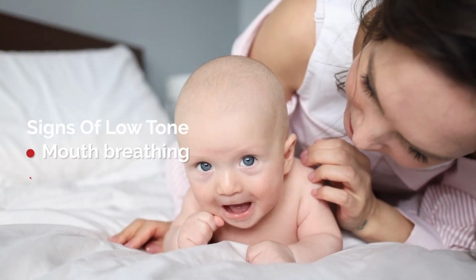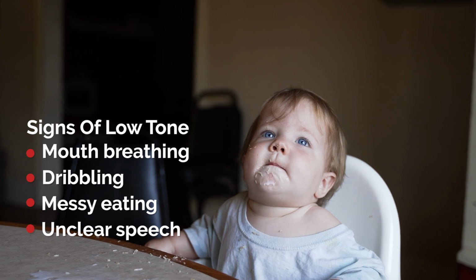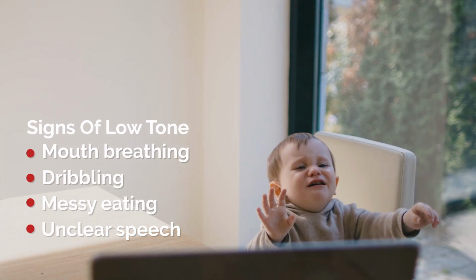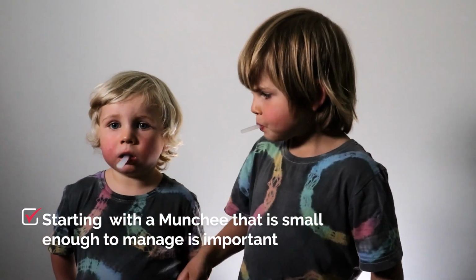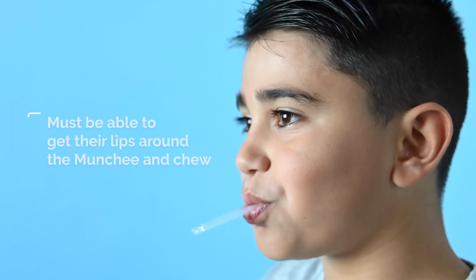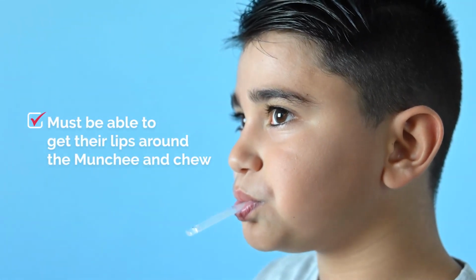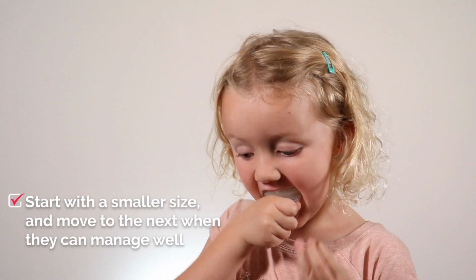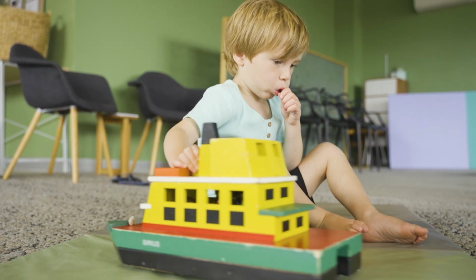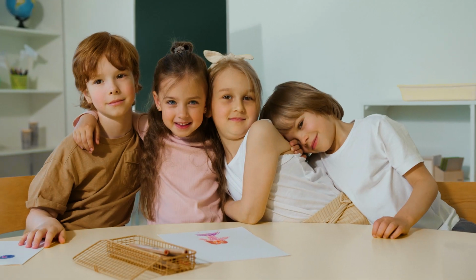So if we have mouth breathing, dribbling, drooling, messy eating and unclear speech, for example, the underlying cause is likely to be low tone. So starting with a munchie that is a small enough size to be managed easily is going to be really important here. They need to be able to get their lips together around the munchie comfortably and then chew. So start with a smaller size and move up to the next size once they can manage well for their age. This is particularly important for the child in the transition age group between 4 to 6 years.